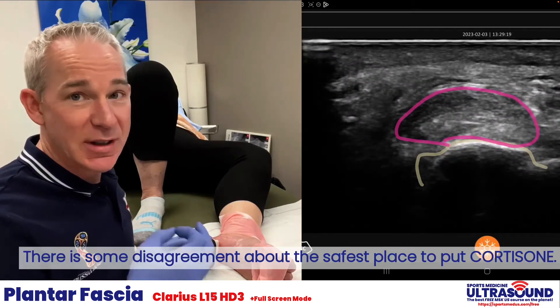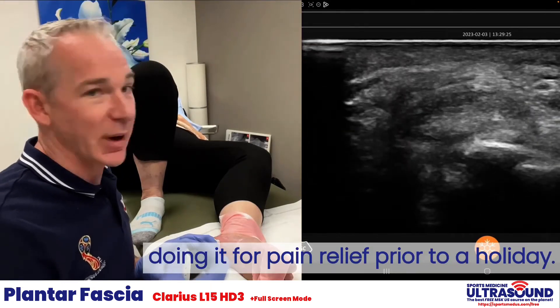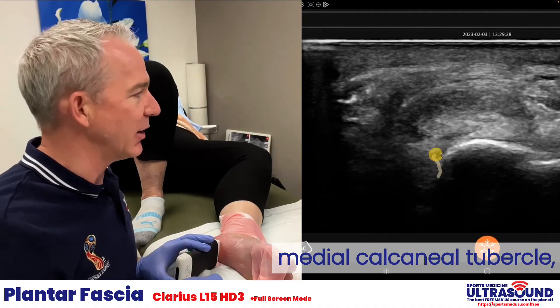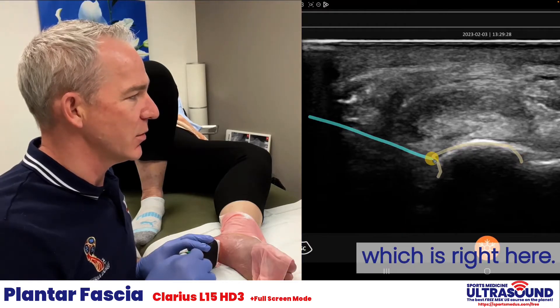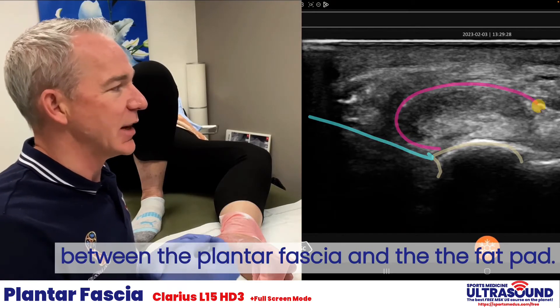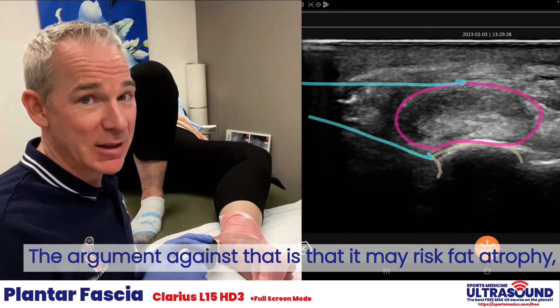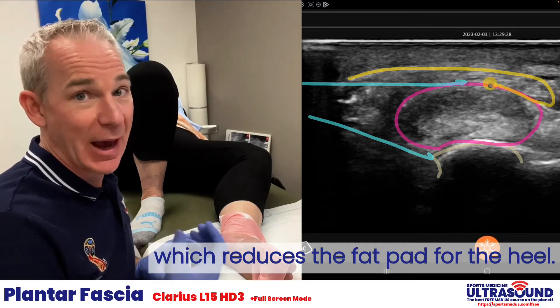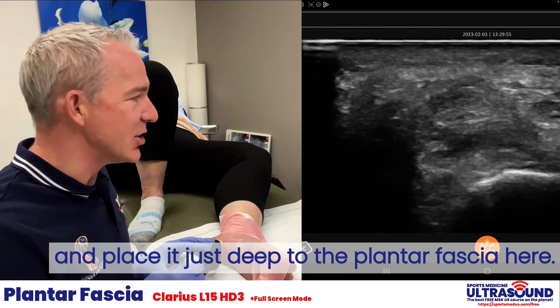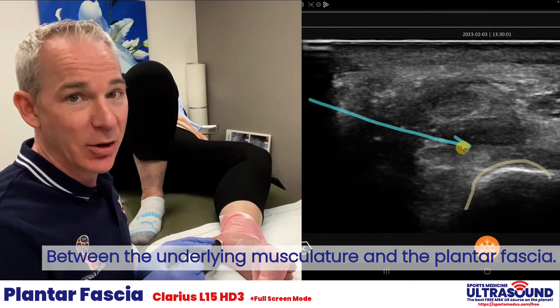There is some disagreement about the safest place to put cortisone, because we know cortisone undermines the health of the tissue. In this situation we're doing it for pain relief prior to a holiday. Some people will place the needle tip onto the medial calcaneal tubercle. Others will place it superficial to the plantar fascia, between the plantar fascia and the fat pad — though the argument against that is it may risk fat atrophy, which reduces the pad for the heel. And some people will scan more distally and place it just deep to the plantar fascia, between the underlying musculature and the plantar fascia.